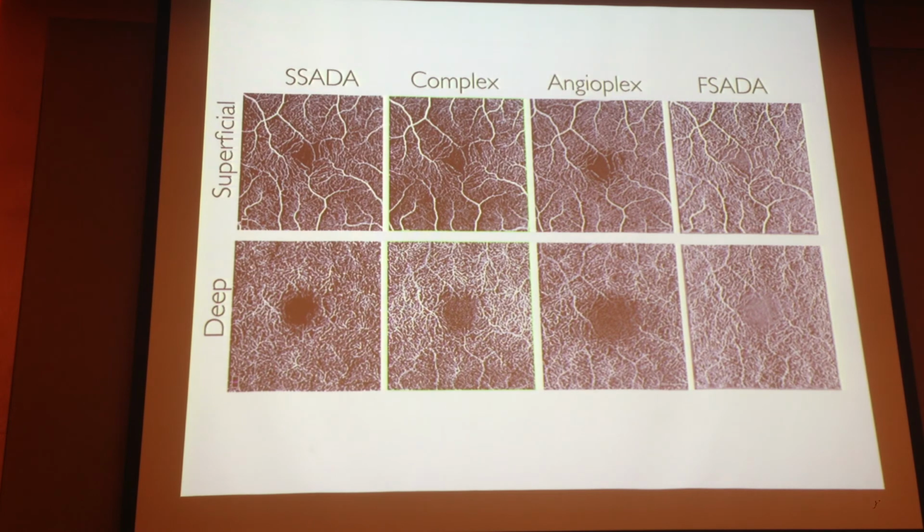If you adjust the segmentation to identify the lesion, when you come for follow-up, will the software remember your choice, or do you need to do it manually? Yeah. At least with OptoVue, and I think also with others, you can save your slab. The problem is that the lesion can change. And with a change in the location of the lesion, you can actually miss it, even if you were at the same position. So you can, but it's always better to move and sample all the layers.